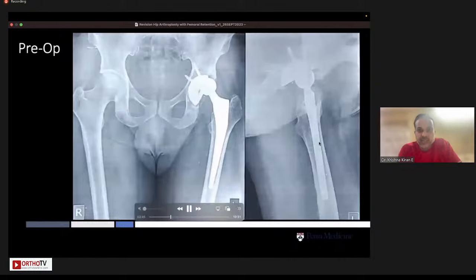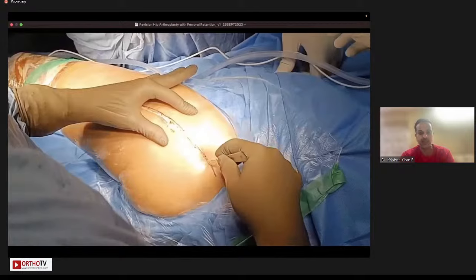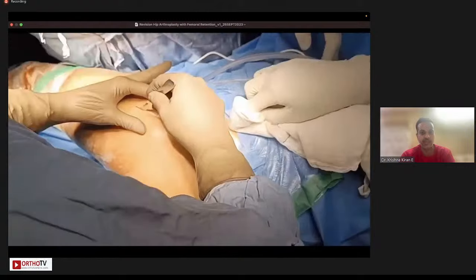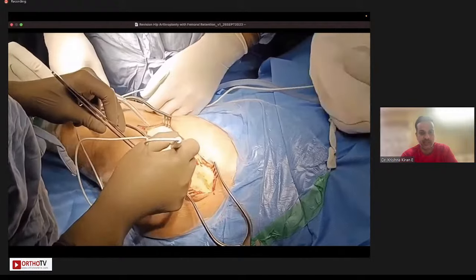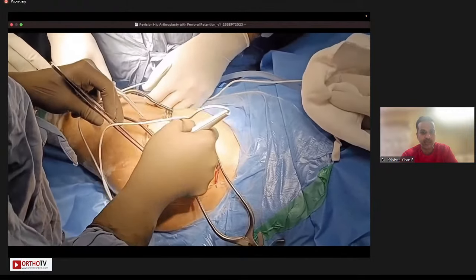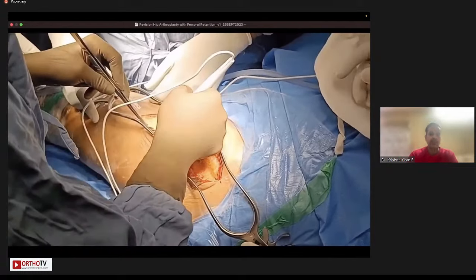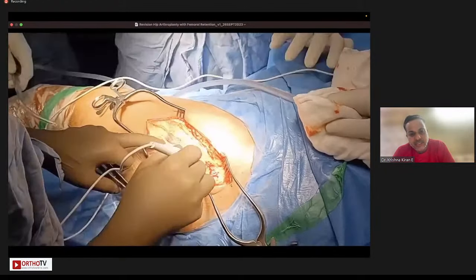So this particular case we are taking to illustrate the point. This is a case of a vertically oriented acetabulum with polyethylene-induced osteolysis and wear of the polyethylene. You can see the eccentrically located head, and the approach is through the same previous incision wherever it is possible. But in a hip, it is more forgiving because of the better vascularity as compared to the knee joint. And we use the incision which is more likely to help us with our exposure of the implant in that particular case scenario.